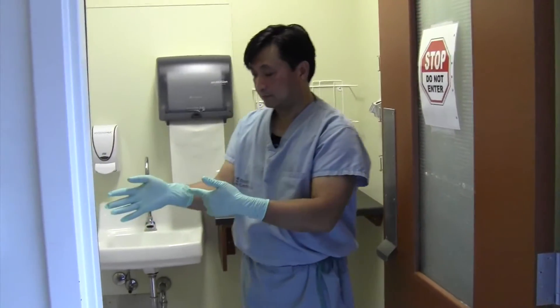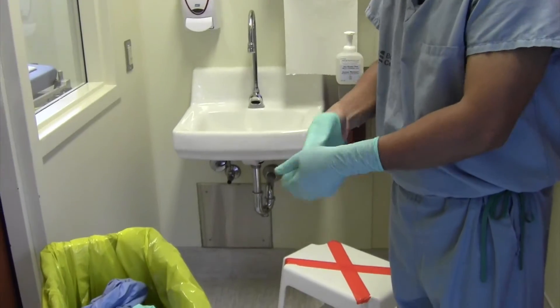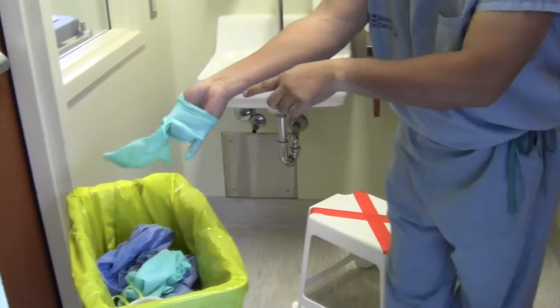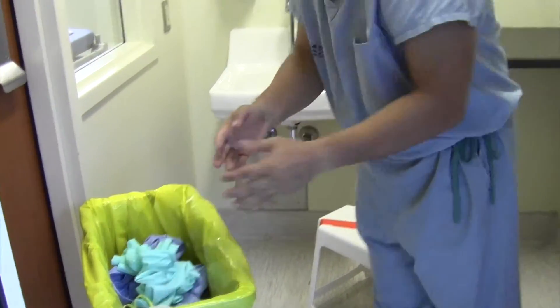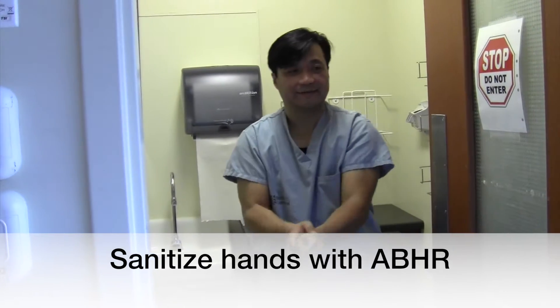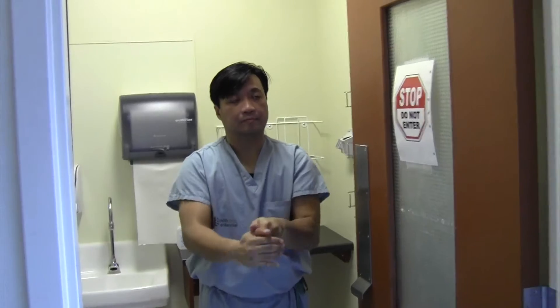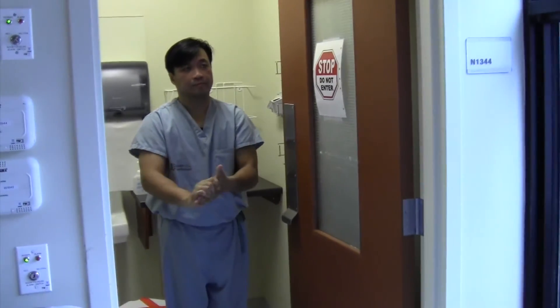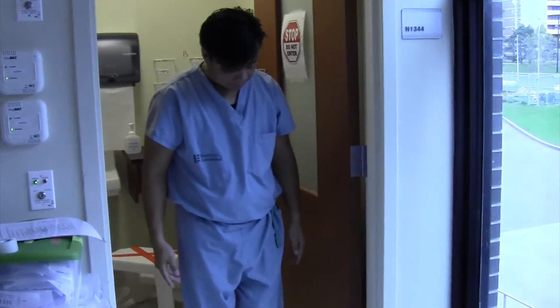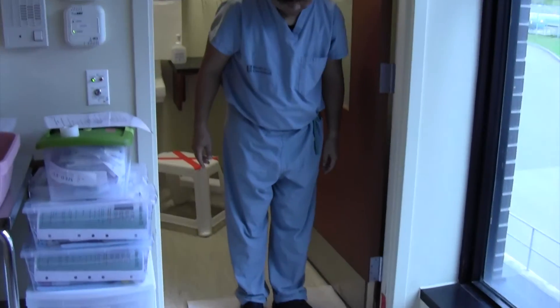Step 15: Remove gloves inside out and discard, using the same technique that was used previously to safely remove your gloves. Sanitize hands with alcohol-based hand rub. You are now ready to leave the room. A walk-off mat will be provided to disinfect your footwear. It is important to stand on the walk-off mat for one full minute to ensure adequate contact time to kill any microorganisms.